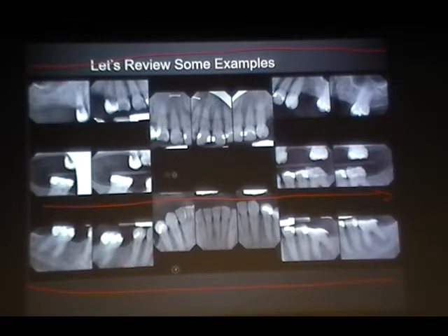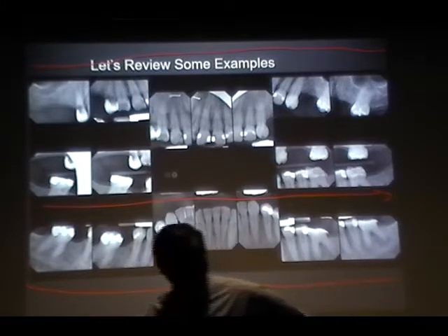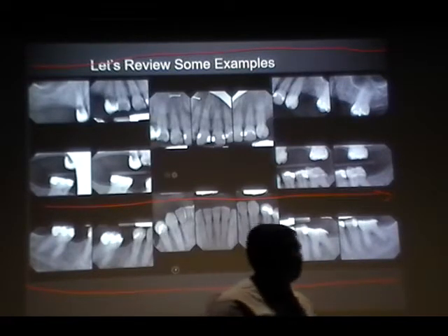I'm going to ask you that question. Okay, whatever you just mentioned, maybe if our time permits, we will be able to cover that topic called radiation safety protocol. I'm going to grill you on that, okay? So now, can the patient hold the sensor? The answer is absolutely no. If I see somebody doing that, he'll be kicked out of the clinic. Okay?